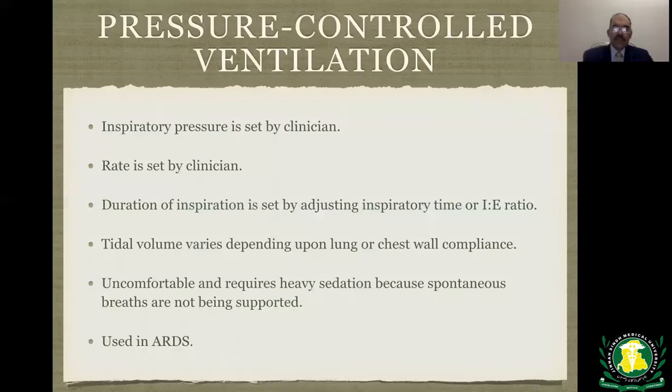Pressure control ventilation. In this, inspiratory pressure is set by a clinician, rate is set by a clinician, and duration of inspiration is set by adjusting the inspiratory time or inspiratory-expiratory ratio. Tidal volume varies depending upon lung or chest wall compliance as well as airway resistance.